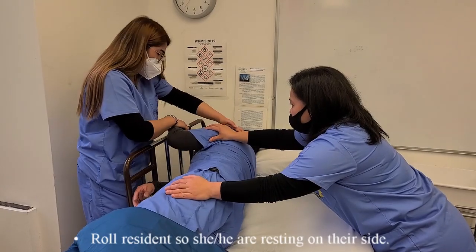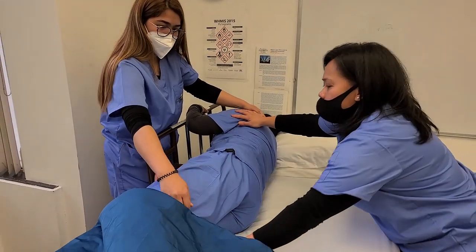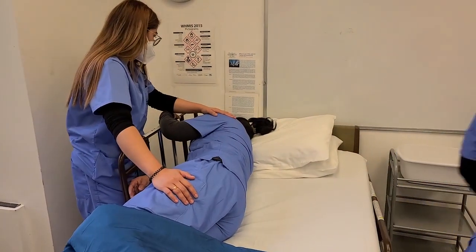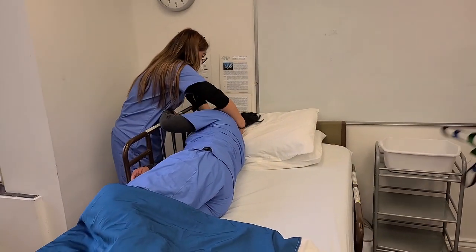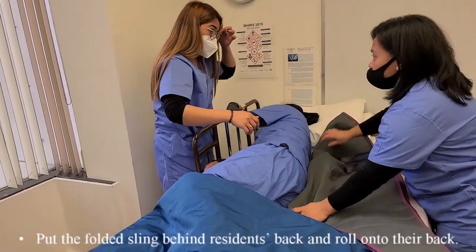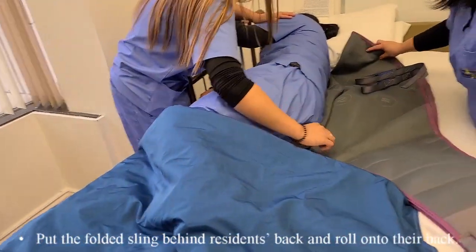Roll the resident so she or he is resting on their side. Put the folded sling behind the resident's back and roll onto their back.